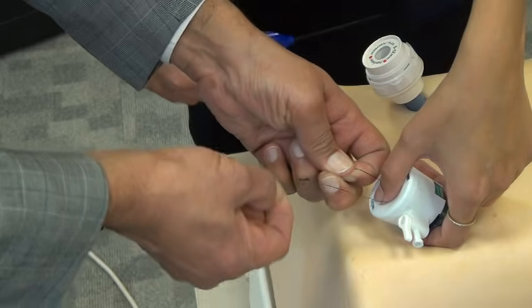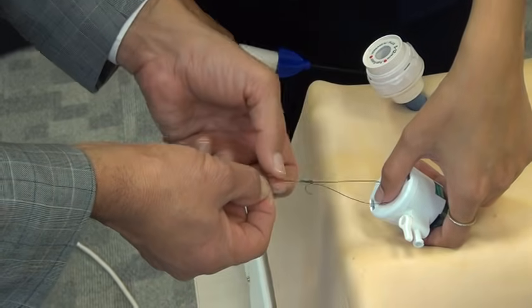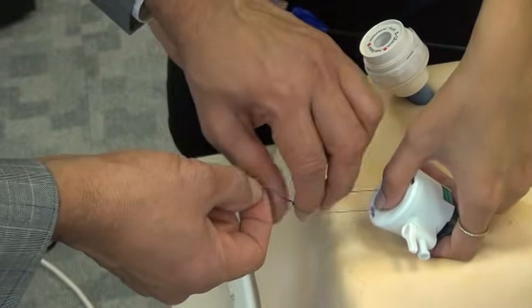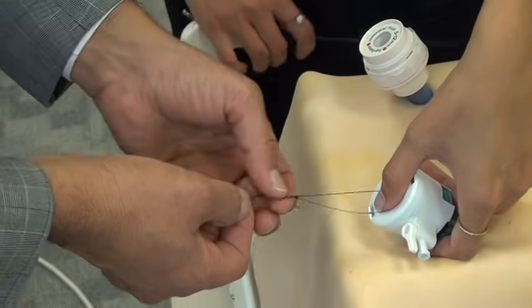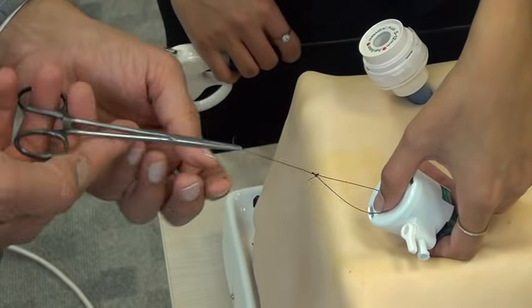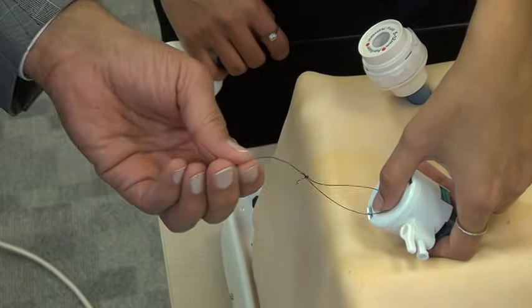Unlock. If you think it's not sliding, and now this end you can release.